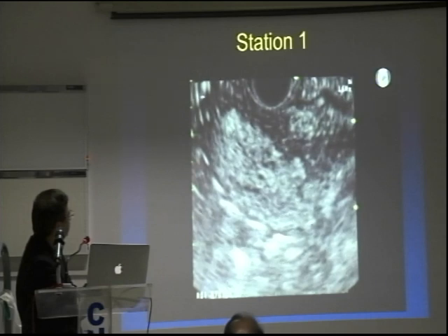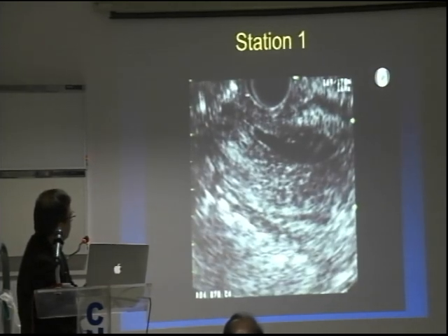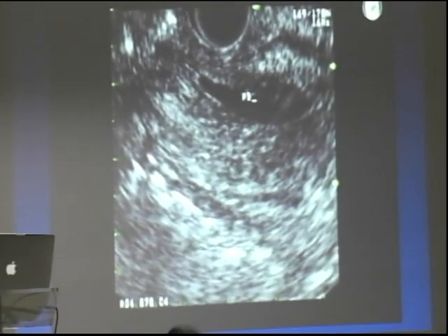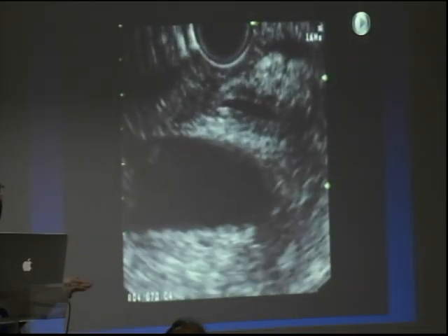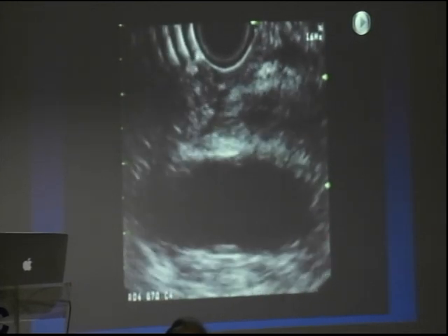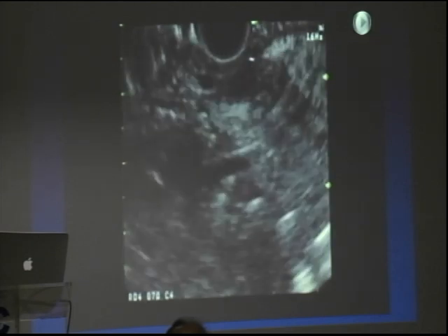Torquing left and right brings the aorta back into view, and at the same time, we can see the pancreatic duct and the uncinate of the pancreas. So it's a pancreatic duct, then to the left bile duct, then aorta, then IVC, and then right kidney. Again, we cannot overemphasize the clockwise and counterclockwise torquing that is necessary to fully interrogate the pancreatic uncinate.